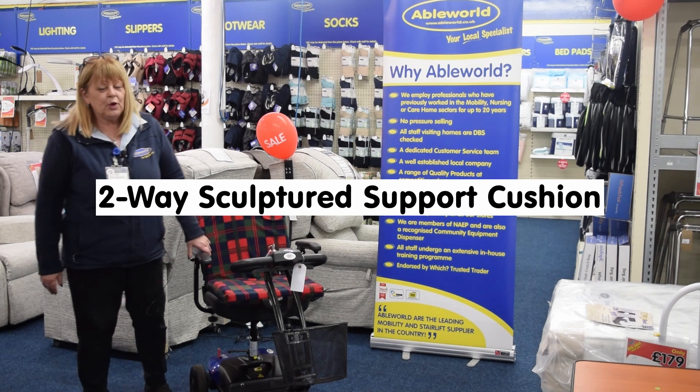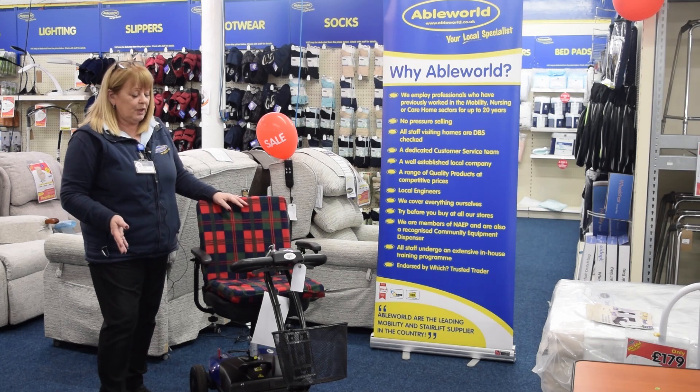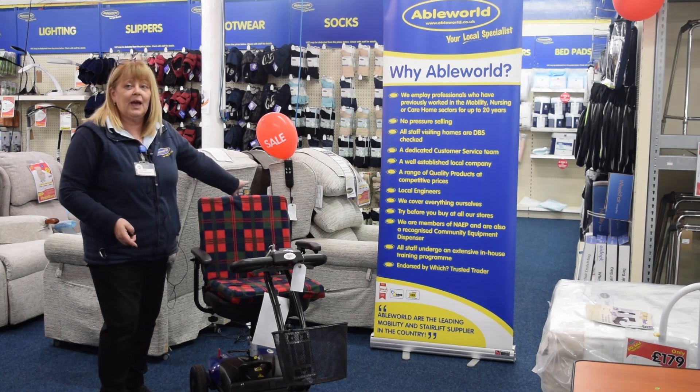What I'm going to show you today is what we call a two-way support cushion. You can either use it on a scooter, a wheelchair, or even on a riser recliner chair.